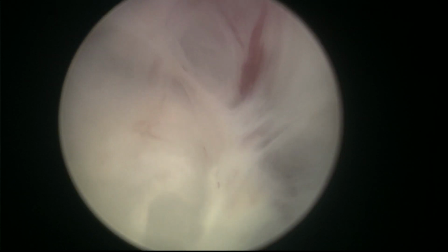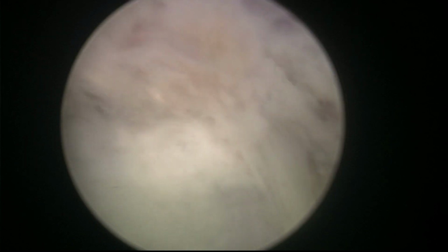As I said, he visited many urologists. They thought that operating on such a large gland is not so easy. We were happy to do it robotically, as we have done other cases like that before, but being obese, he is not a very good surgical candidate, and so this was the final option. Sometimes in patients with extremely large glands, you cannot apply the protocols exactly the same.